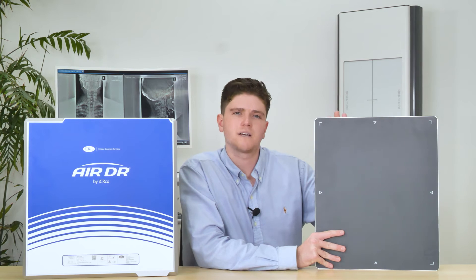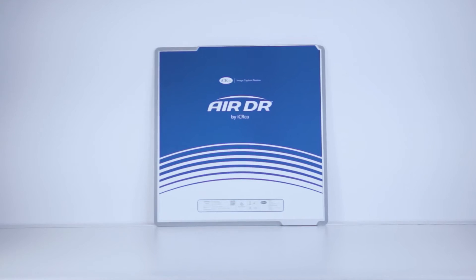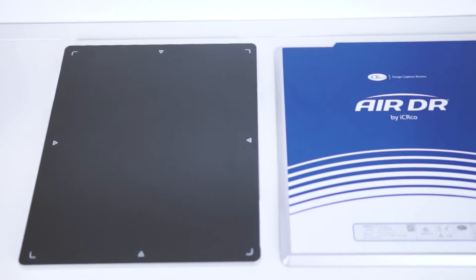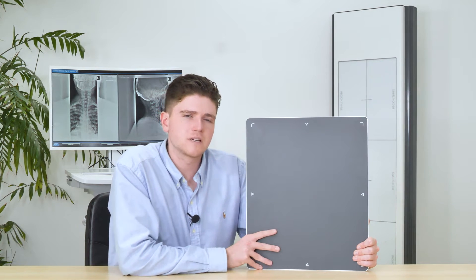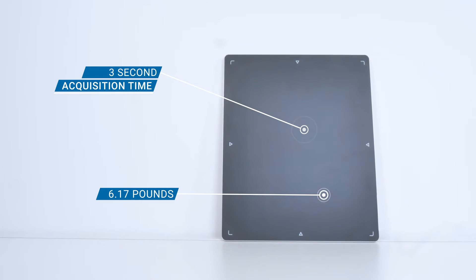The AirDRP is our 14 by 17 wireless panel, whereas the AirDRCP is our 17 by 17 tethered panel. Each panel comes with the options of either cesium or Gadox scintillators. Our wireless AirDRP comes with a 3 second acquisition time and is extremely lightweight, weighing just over 6 pounds.